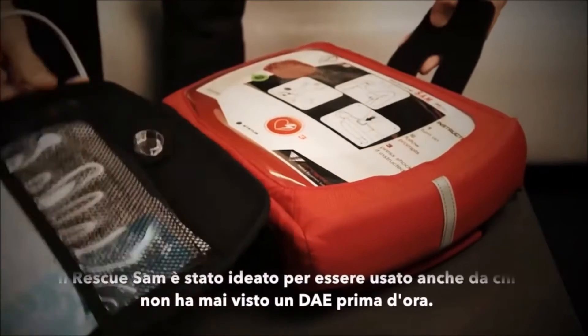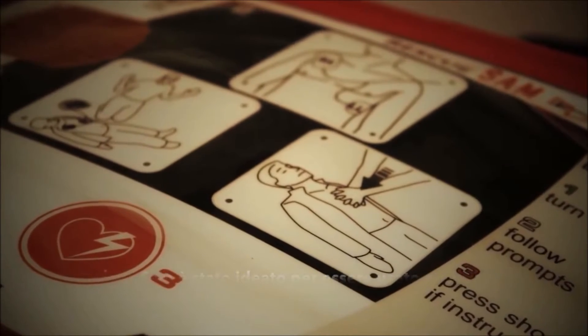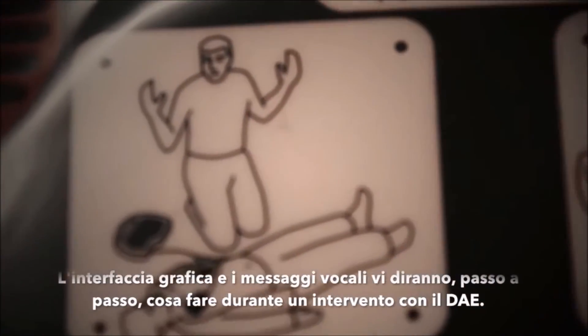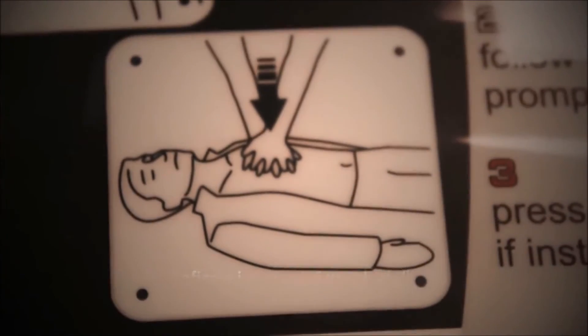The Rescue Sam is designed to be used by anybody, even those with no experience in resuscitation. The main interface has graphics to show how the pads are applied to a person and how to perform CPR, with loud and clear voice prompts.